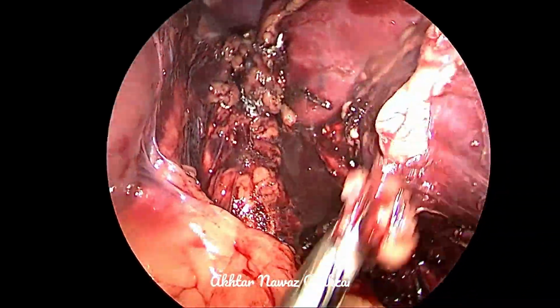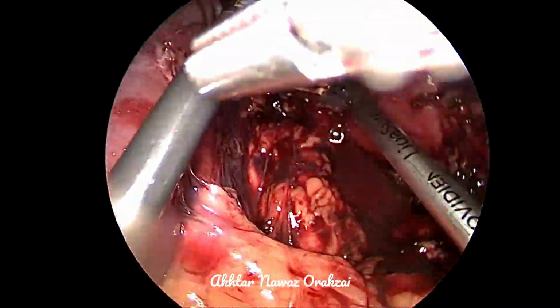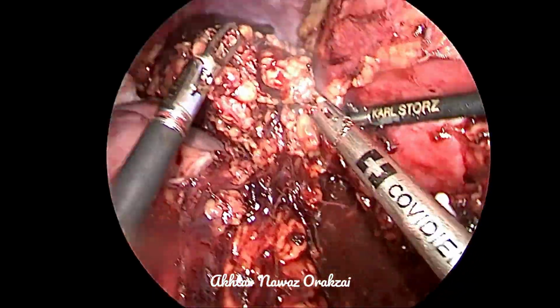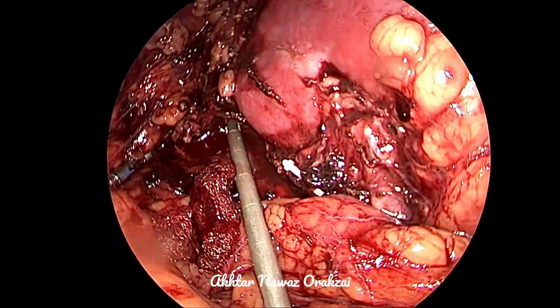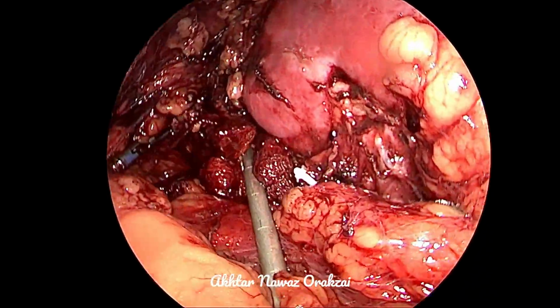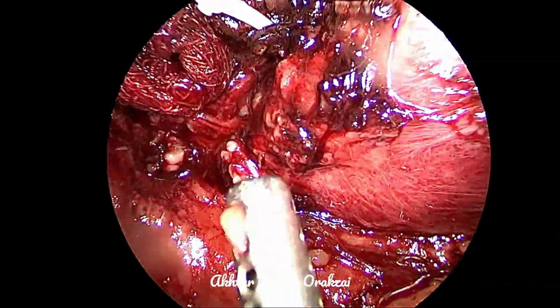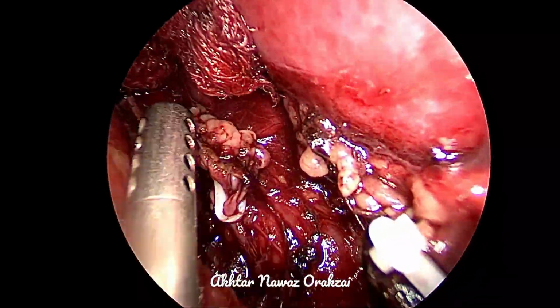And we rotate the gland upwards to see which area is remaining. This is the normal portion of the gland as well, and it is done. So after that we do the suction. We reduce the pressure to 6, and we see if there is any ooze or bleed. The kidney is beautifully pink, ensuring its blood supply. All the clips are safe and secure.